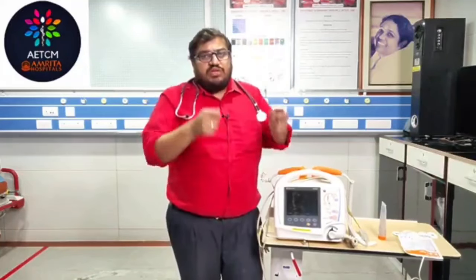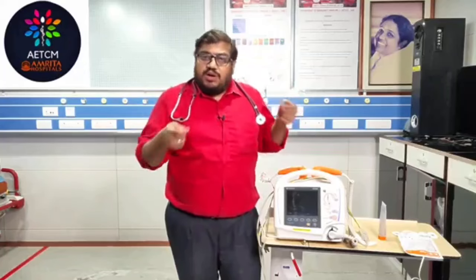Because in defibrillation, we'll just deliver the shock and we'll come out. But in synchronized cardioversion, you need to keep it for another couple of seconds so that the shock will be delivered. The machine will identify the peaking of the R wave and the shock will be delivered.